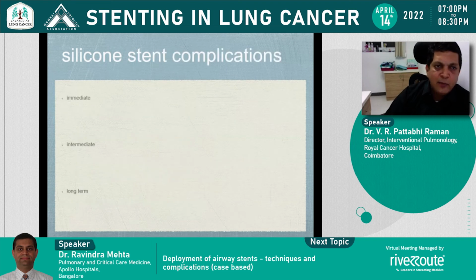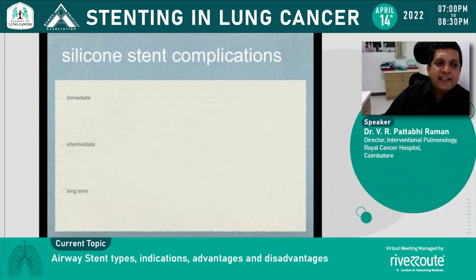And again, the complications have been dealt with. Just to reiterate, there can be an immediate complication. The most important complication, especially in the straight stent, is migration. There can be inability to deploy, which is a technical issue, and probably by experience, it should be all right. Sizing issue is usually an important thing.